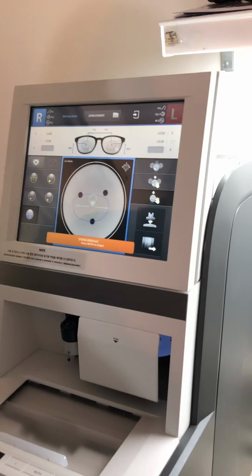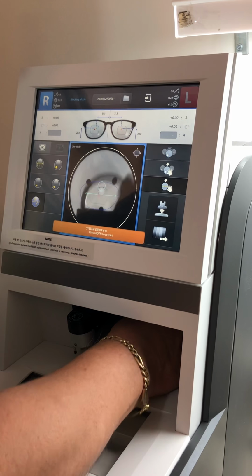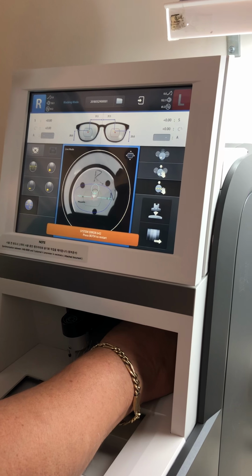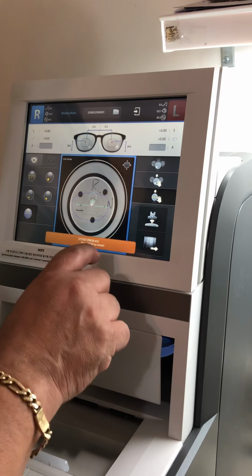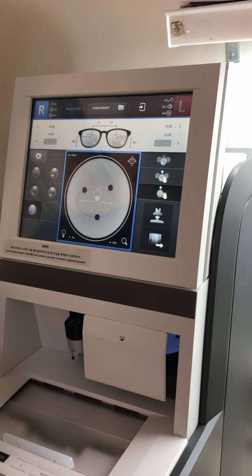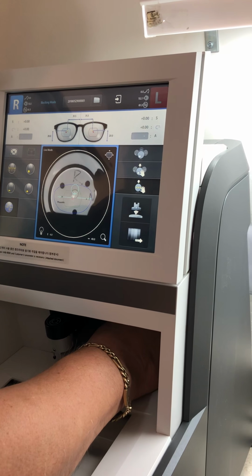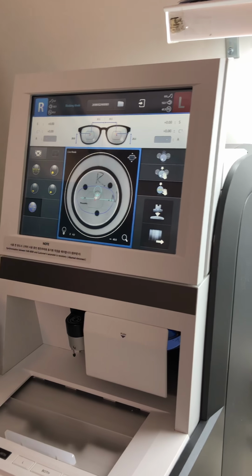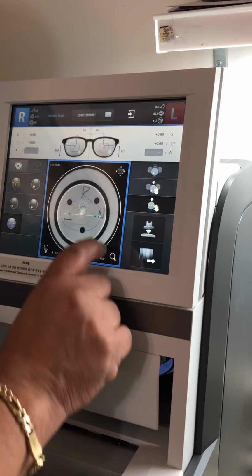So when you have a progressive, you're going to come in here. It's got an error, but that's all right. I'm going to come in here, and I'm going to line up my engraving marks. And are all these pretty much the same? Oh, jeez, let me get this error out of here. It's because I'm going back and forth, moving everything. All right, so we're here. Say, for example, I wanted my engraving marks, and I'll find out whatever they are on your engraver, and I can set it to the default.